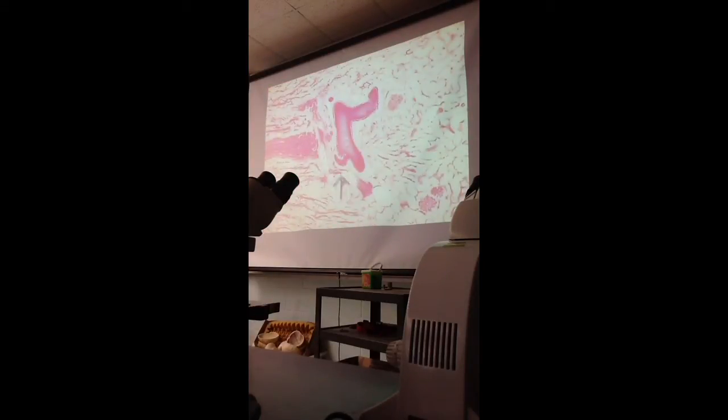Okay, I am seeing a large blood vessel. I know that this is a blood vessel because it has dye. I know this is where you have the peritubular capillaries. It's all medullary pyramids, and this portion where you see the glomeruli is the cortex. What could be this blood vessel? The blood vessel that arches on top of the pyramids. Arcuate. That's the arcade. We don't know if it's the artery or the vein. I'm thinking it's an arcuate artery.